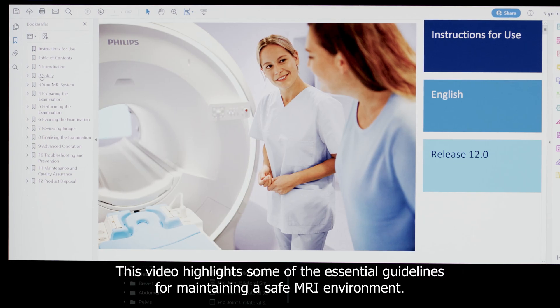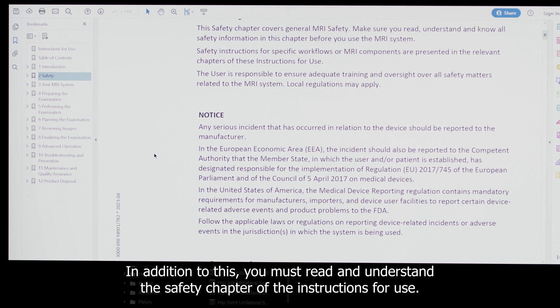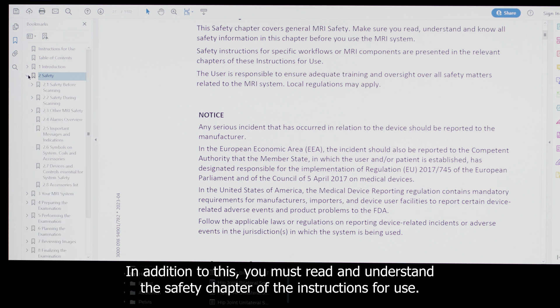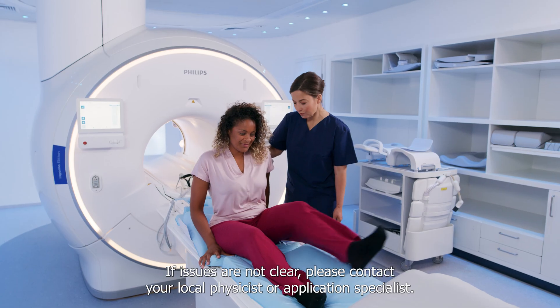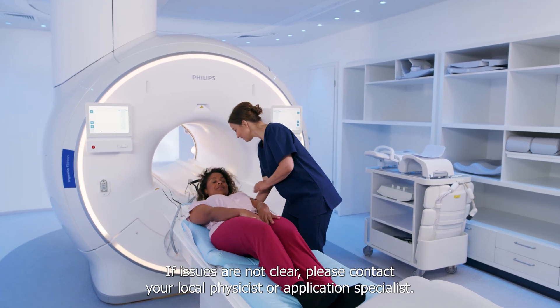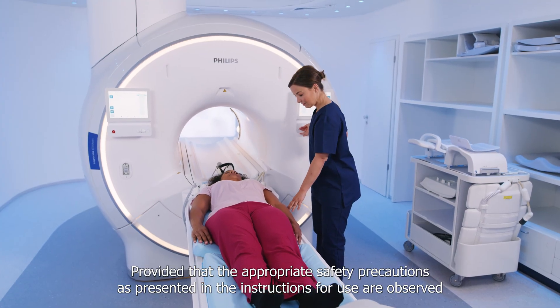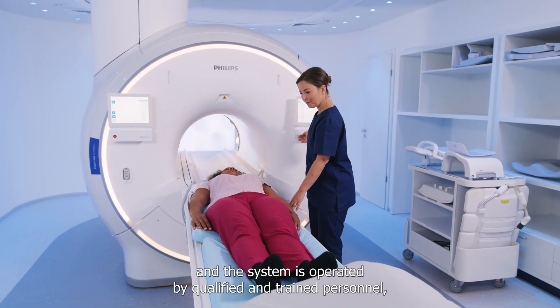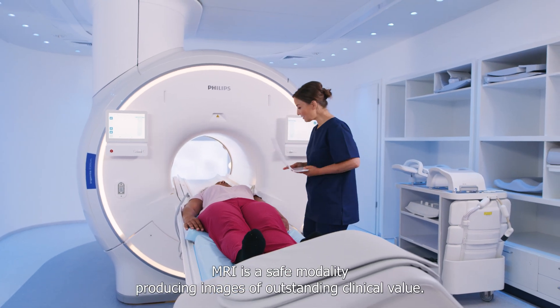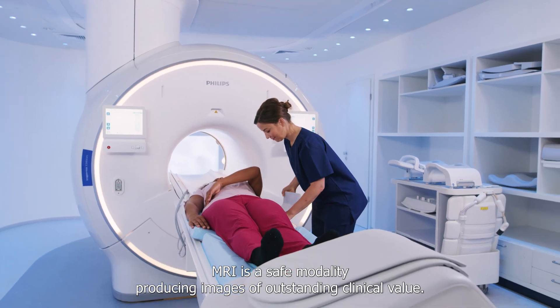This video highlights some of the essential guidelines for maintaining a safe MRI environment. In addition, you must read and understand the safety chapter of the instructions for use. If issues are not clear, please contact your local physicist or application specialist. Provided that the appropriate safety precautions as presented in the instructions for use are observed and the system is operated by qualified and trained personnel, MRI is a safe modality, producing images of outstanding clinical value.